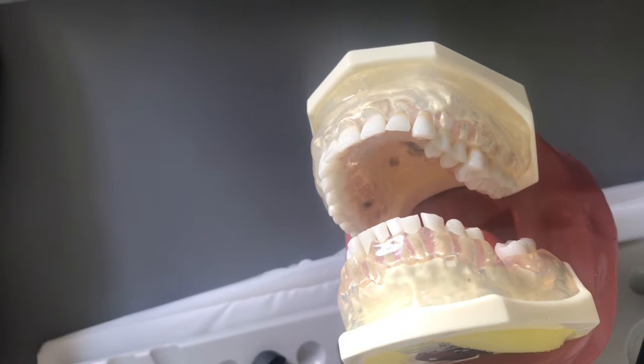So I put my patient in a nice relaxing position and I'm going to start with my 15-16, which is used for the facial or lingual and mesial aspect of the tooth. To start off, I'm going to start with the maxillary, and the must-see areas are the linguals and the maxillary. So I'm going to start with the right maxillary. I will be in 11 o'clock position.